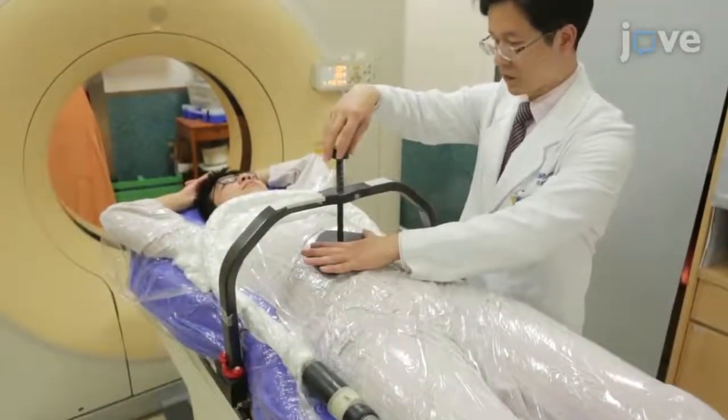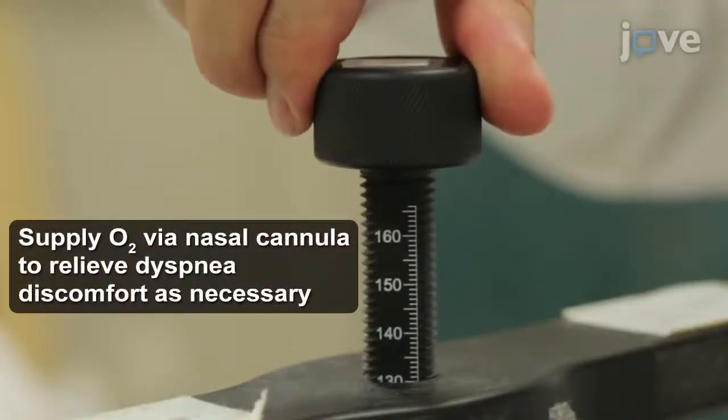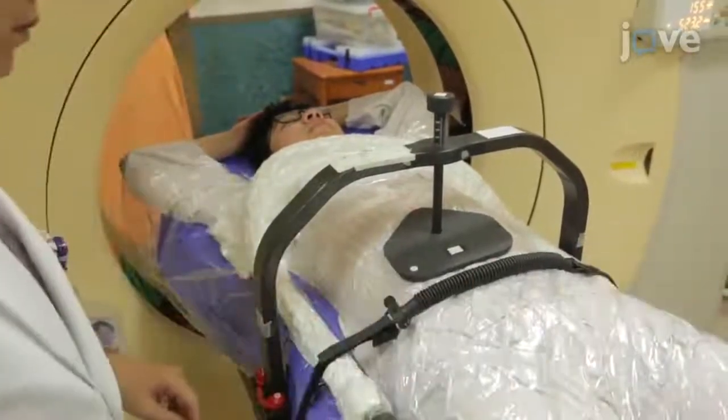Apply an abdominal compressor and mark the depth of the compressor. Then, place a breath-tracking sensor on the chest wall and monitor the respiratory waveform.